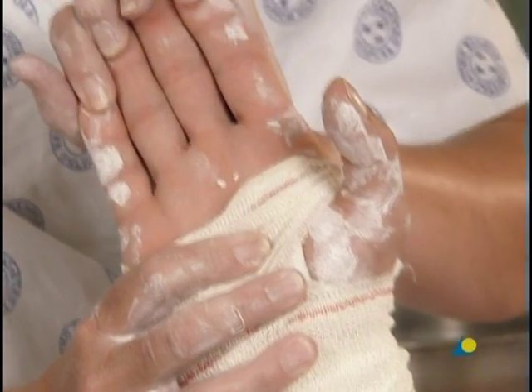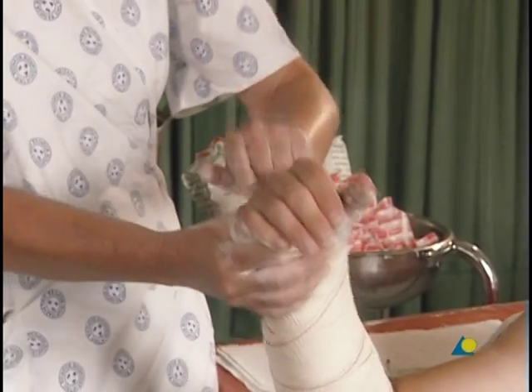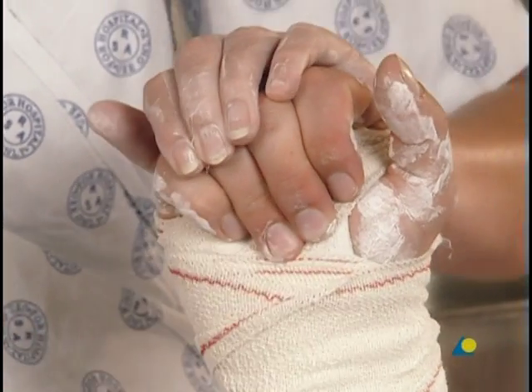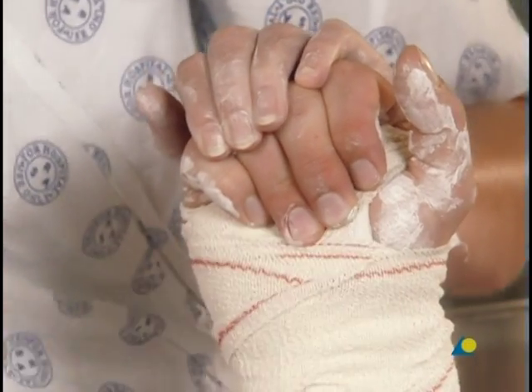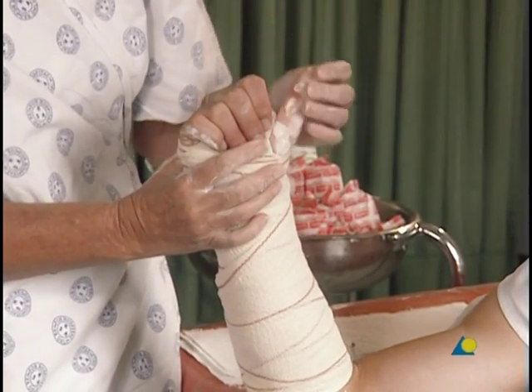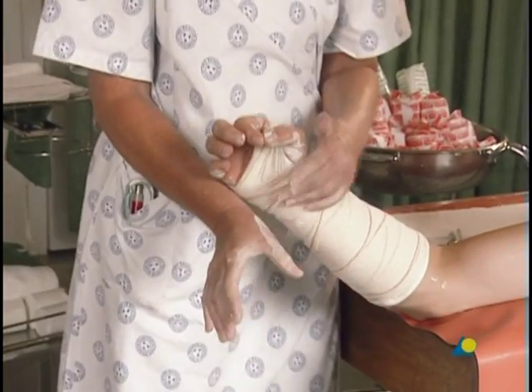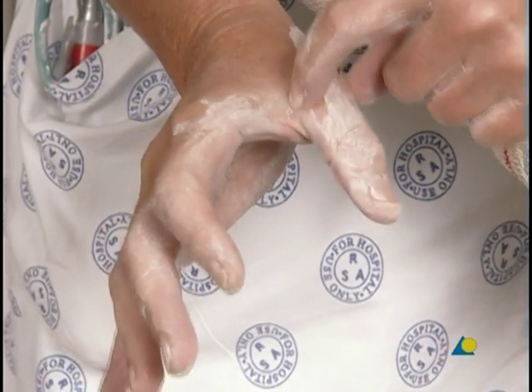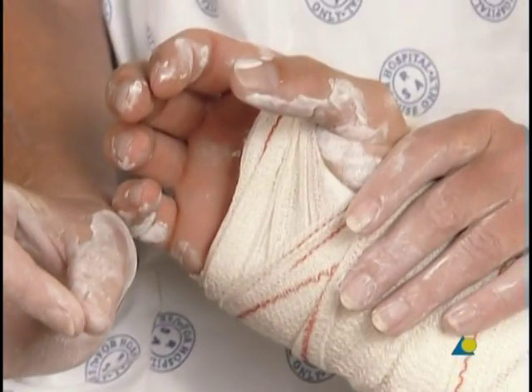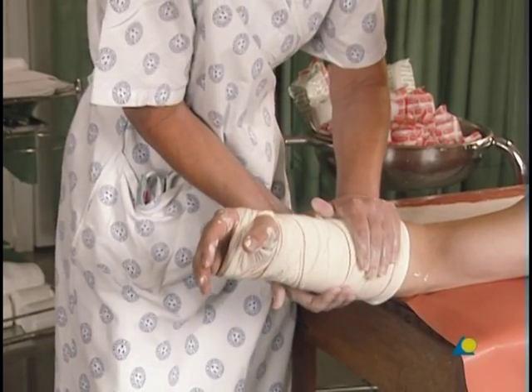The exercises for the patient may now be explained and demonstrated. They include full flexion of the MP joints, full flexion of the PIP joints, and placing the ends of the fingers into the palm of the hand. Flexion of the thumb is verified. Because of the relatively small space between the heads of the first and second metacarpals, the volar slab should not be too wide in the web space, so that the patient can continue to pinch the thumb and fingers together. The application of the volar slab is now complete.